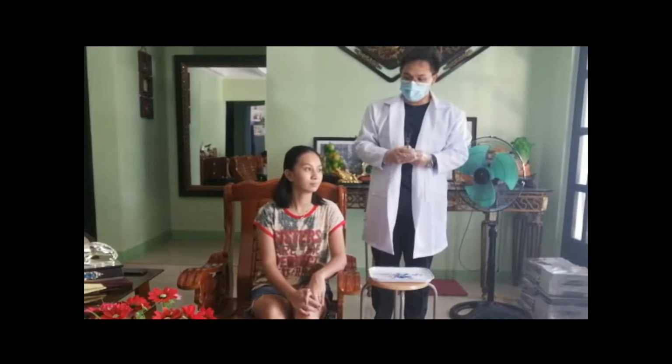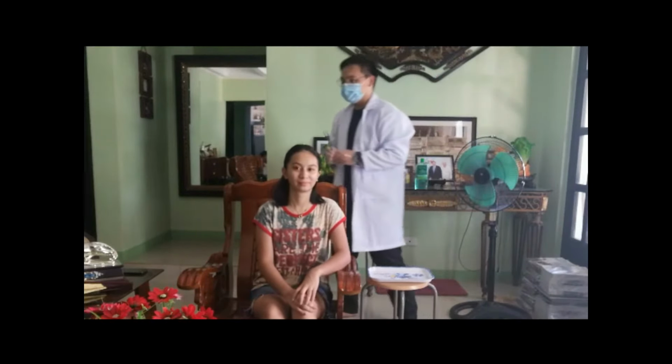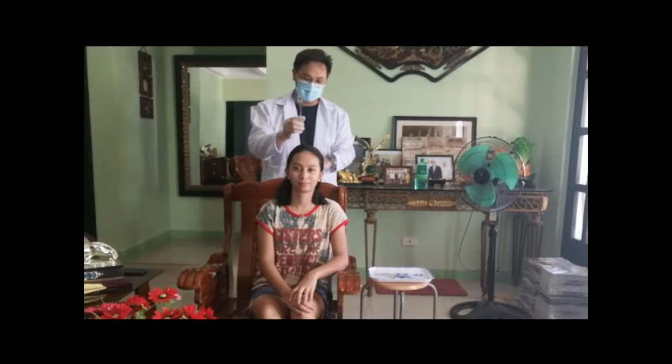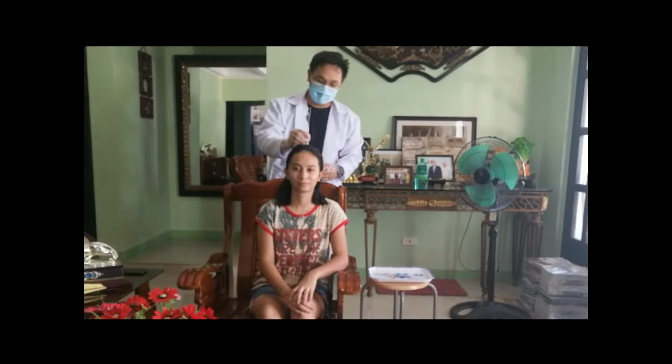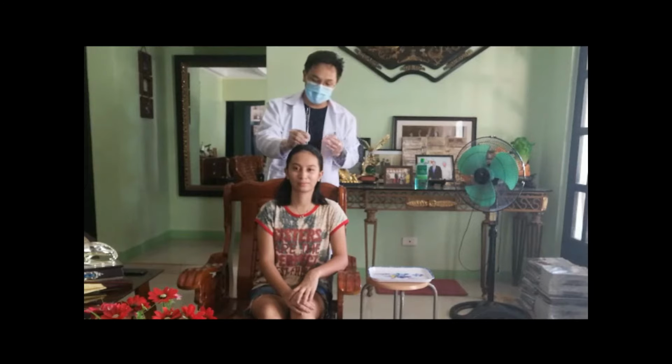And i-ask lang natin siya kung may naririnig ba siya, kung mas malakas bang naririnig niya sa kanyang right ear o mas malakas ang kanyang naririnig sa kanyang left ear. Or pwede rin naman kung ang naririnig niya ay balance sa left ear and right ear. So ma'am, ikakanda ko na po ang Weber's test. Okay lang po? Yes. Okay po. Naririnig niyo po ba yung sound ma'am? Opo. Alin po ang mas malakas? Yung left ear po o yung right ear po? Pareho lang. Okay po.